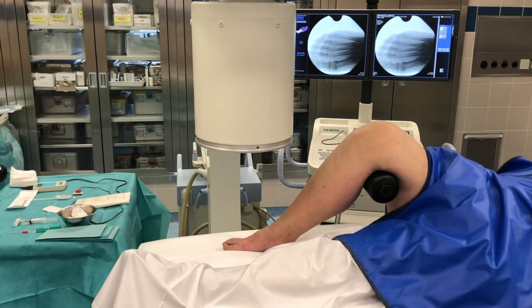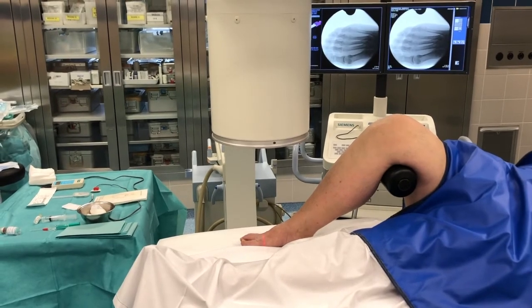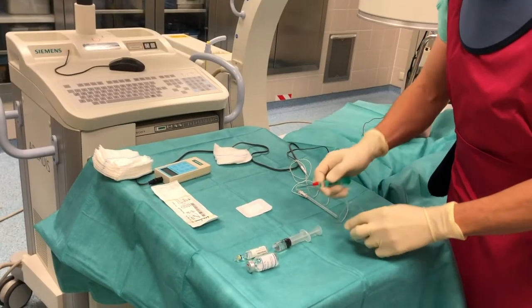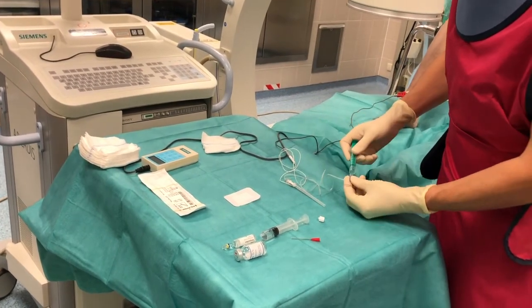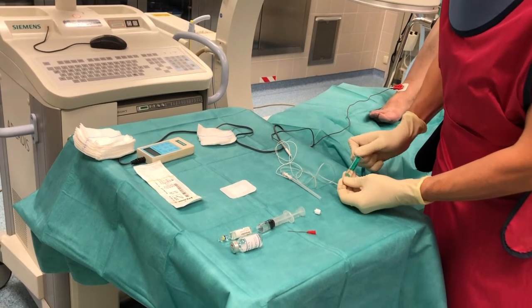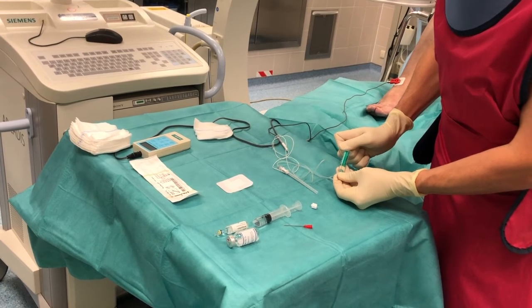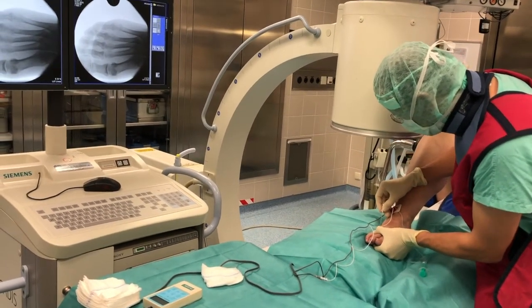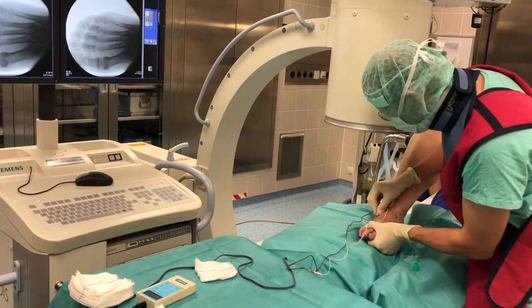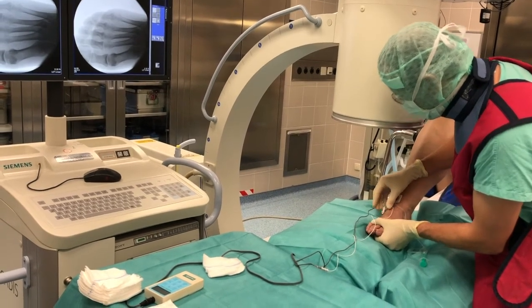Regarding the positioning, we use a leg holder in order to make a good dorsoplantar radiograph. First I de-air my injection needle with 0.5 ml of ethanol. I try not to let the ethanol drop out at the tip of the needle because this causes pain when I inject. Here I inject approximately 3 or 4 cm proximal to the MTP joint and I try to aim at the joint line with my 25 degree angle.